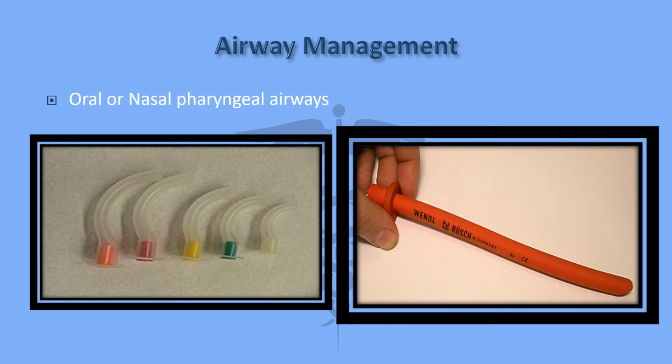So the oral airways are pictured here on the left of the screen. The oral airway, also known as the oral pharyngeal airway, comes in a variety of sizes. It's placed whenever the patient's not able to maintain an open airway, so usually under anesthesia, or with some type of head injury. The nurse is able to insert it. We do talk about them in the perioperative lectures.